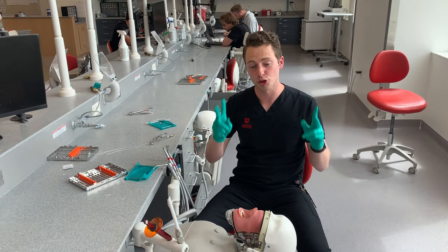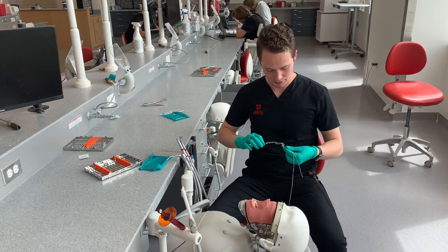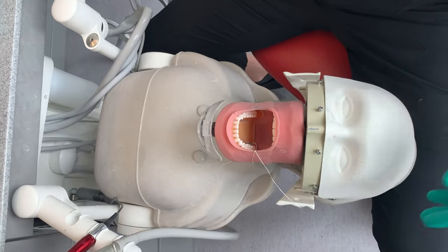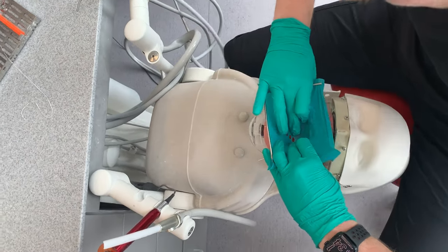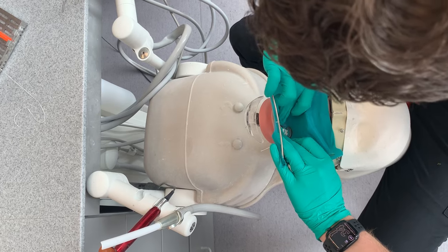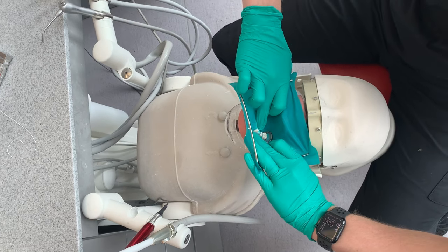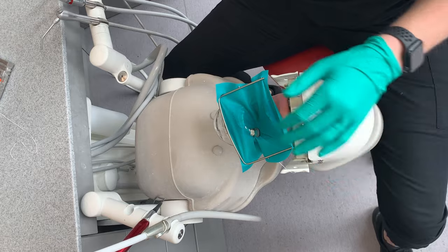I want to show two more ways that you can place a rubber dam with wingless clamps. The first one is to simply place the clamp on, grab your dam, stretch it over, then put in the contacts and set it all up. So that's one option.